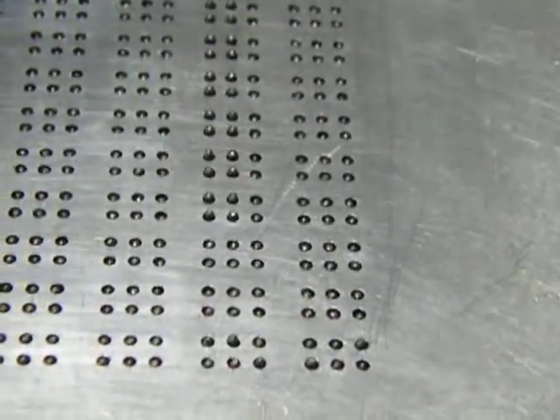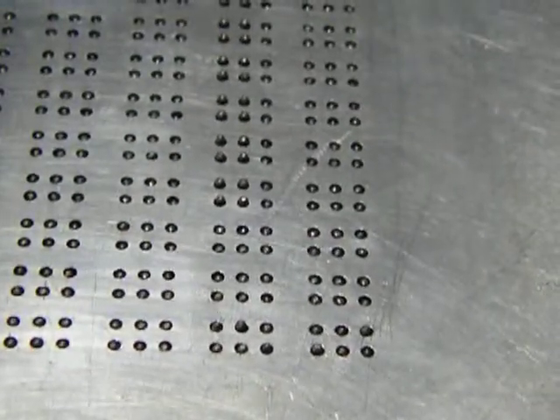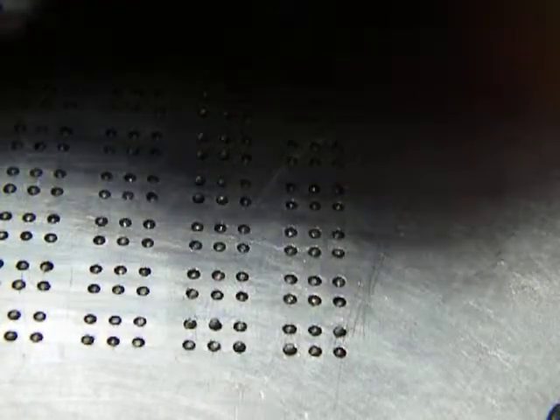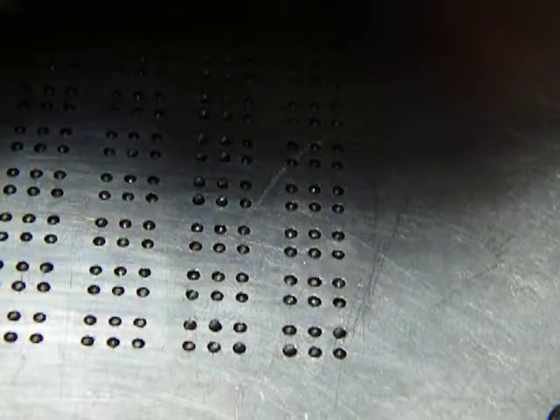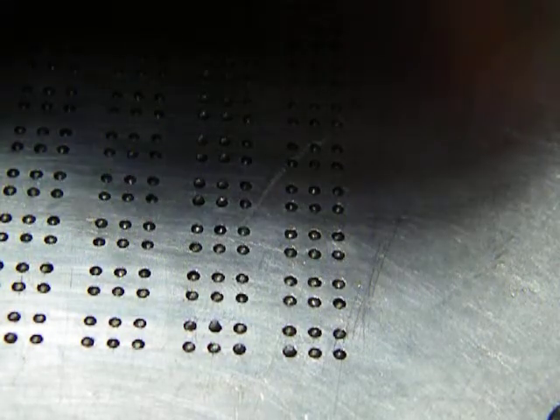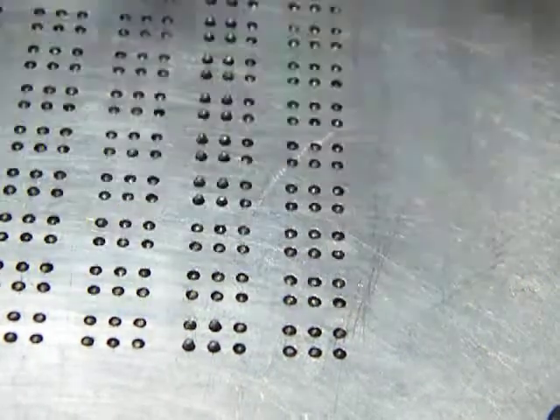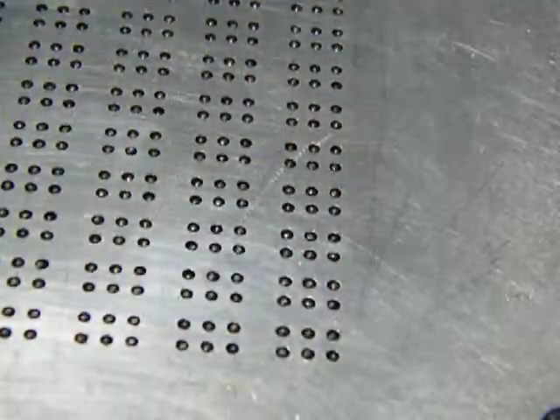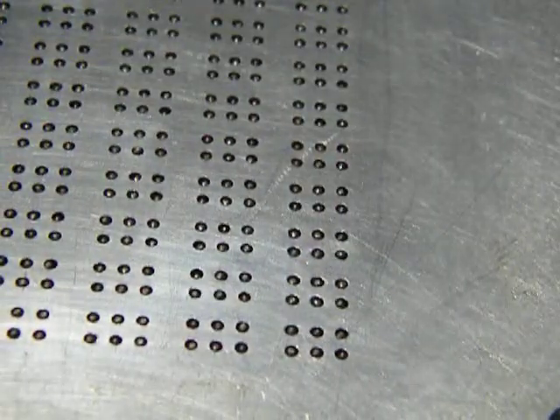So if you want to release them, normally the moment you enable a column latch, you set a column latch, it basically releases the pins to let them drop by gravity to zero. So the moment we do that, the pins should drop to zero. That is when the row actuators are open. So what's happened now, they've all dropped to zero. So that's basically how this works.